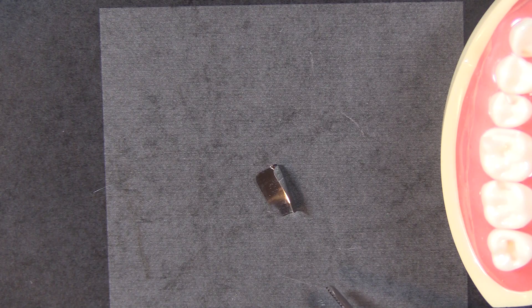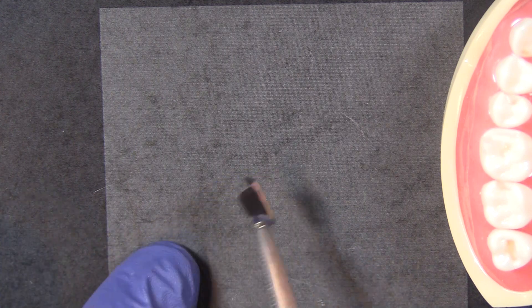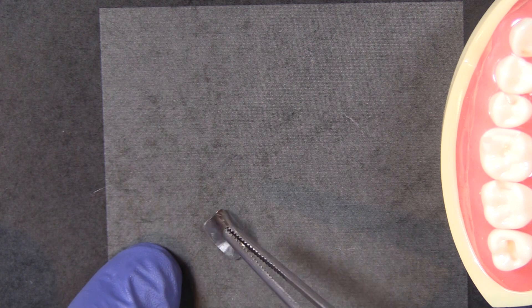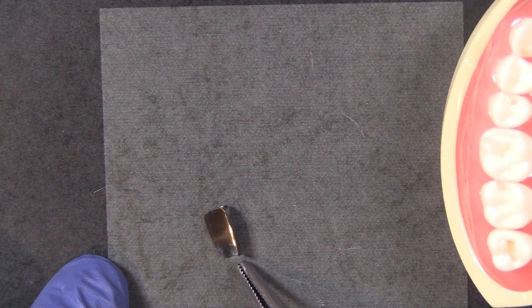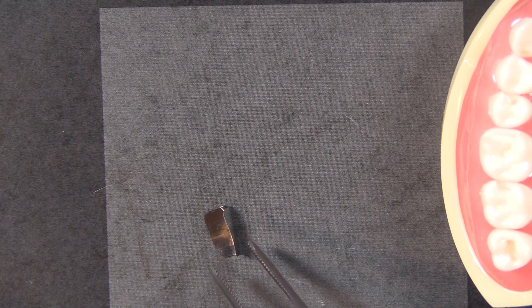Hi, this is Kevin with Garrison Dental Solutions. I want to give you a quick tip on using the Fusion anterior matrix system and the placement of these little bands. They are narrower on one side and wider on the other, and that's to allow you to place them in the most advantageous way depending on where the restoration is on the tooth. Let's demonstrate that.